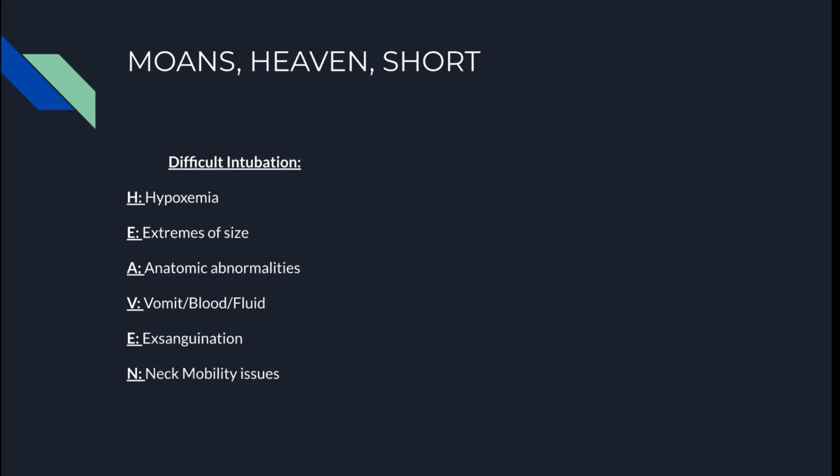Extremes of size, as we mentioned, patients with larger body habitus, they're going to have more tissue, more weight. Positioning wise, we're probably going to have to ramp these patients up. It's just going to be more difficult.